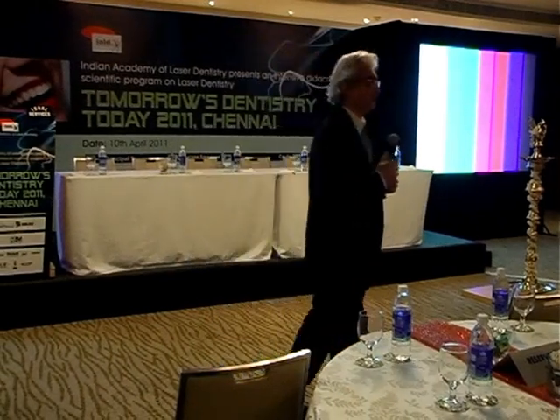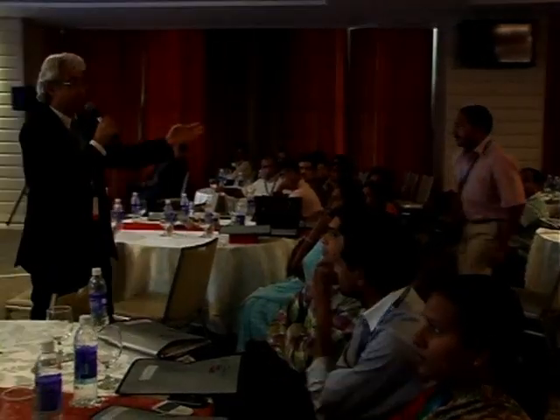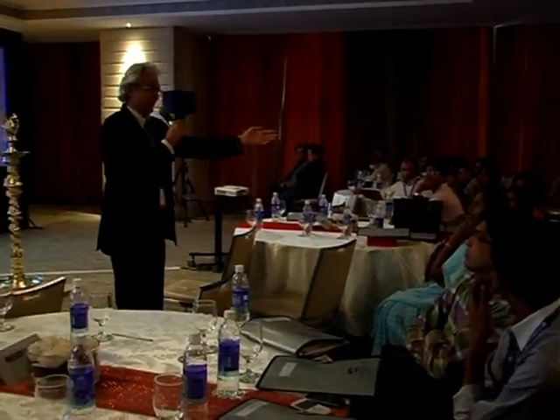Any other questions while we are preparing for the next patient? How will you differentiate clinically that the infected dentin is completely removed and the affected dentin is retained? You can use the Diagnodent, which is a diagnostic laser, if you want.